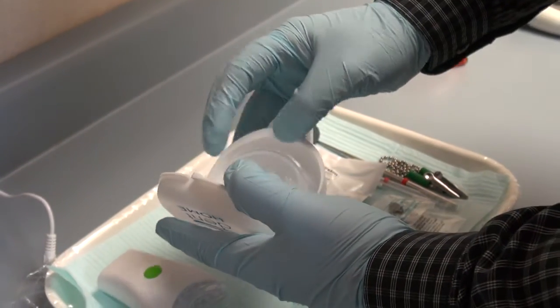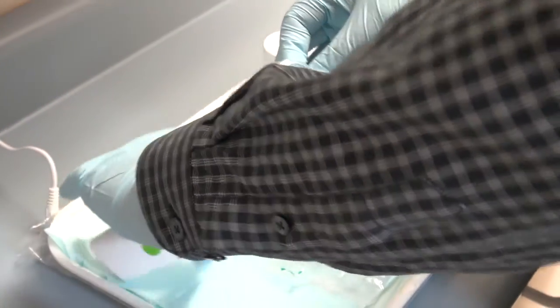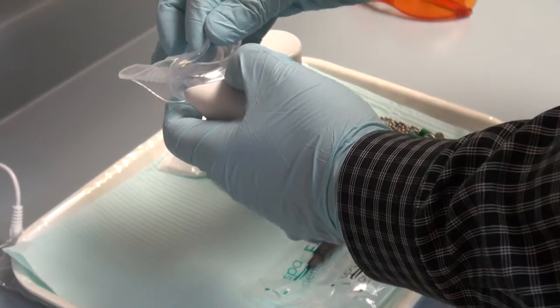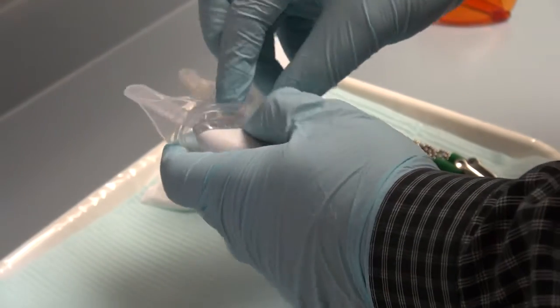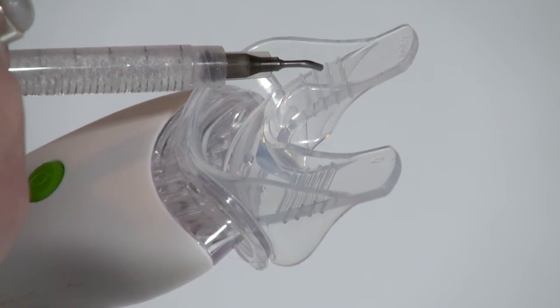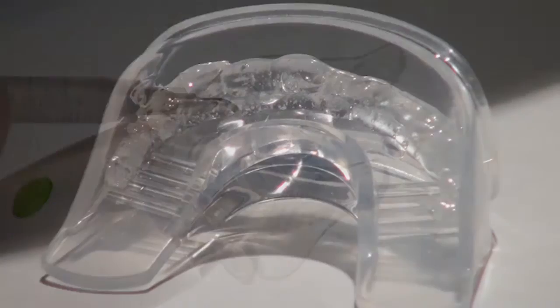Securely connect the tray to the whitening pod by inserting the top edge of the light into the tray and then attaching the bottom edge. Always attach the tray to the pod before dispensing gel to ensure a mess-free attachment. Next, attach the tip to the whitening gel syringe and apply a thin layer of gel along the leading edge of the tray, both top and bottom, ridge to ridge.